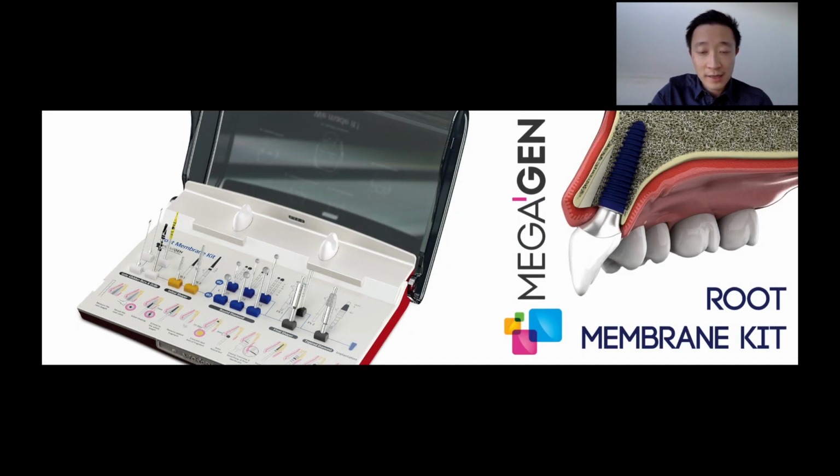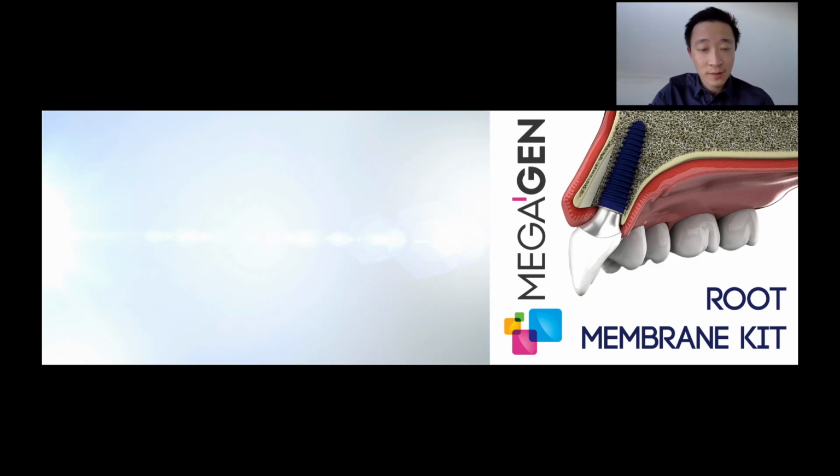I'll go over next the root membrane kit that's offered by Megagen. This is one of those wonderful tools that they offer for us. As many of you probably already do this, I won't go into too much detail, but this video just shows you the steps on achieving a socket shield and how to place an implant in the correct position.